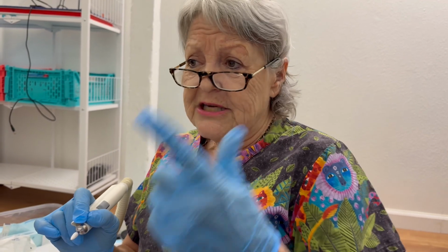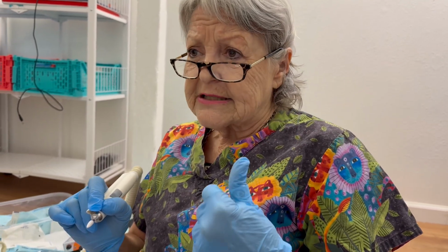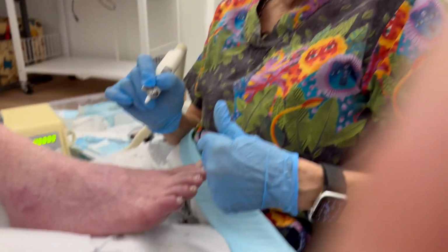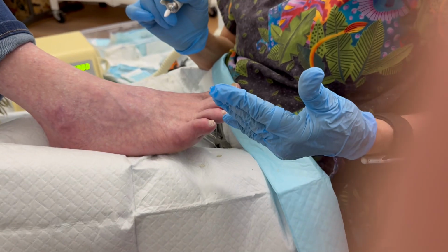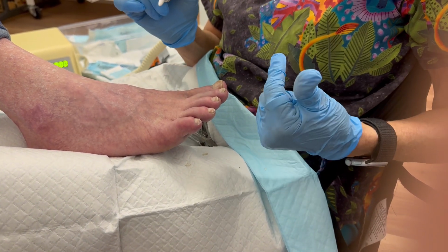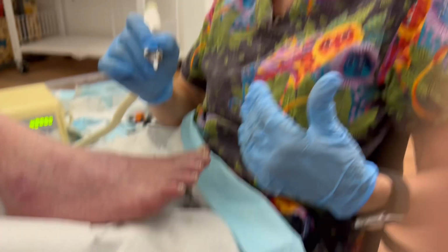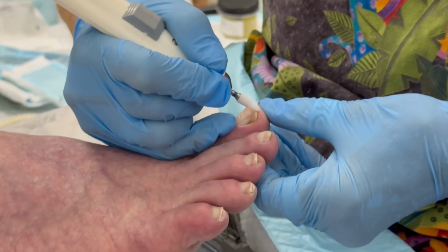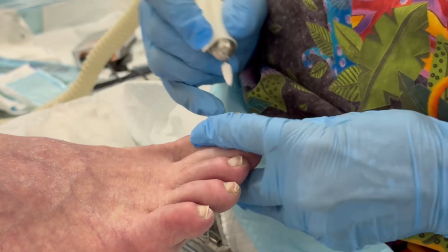And a diamond burr. I remember specifically one nurse said, I had a patient, she lives an hour away. I had to have her come in 3 times for an hour each appointment just to try to thin the thick nail. It's because she was using the wrong burr. If she had used a carbide burr, she could have done it in one treatment in 5 minutes. So it's about the equipment. That's what I have kind of brought to the scene of foot care.